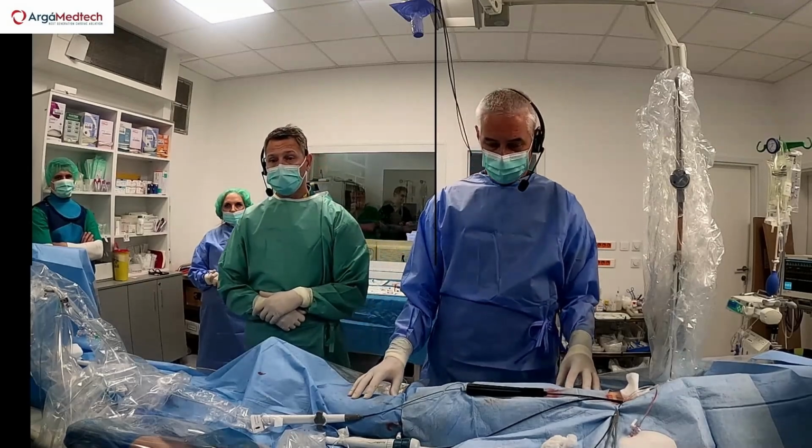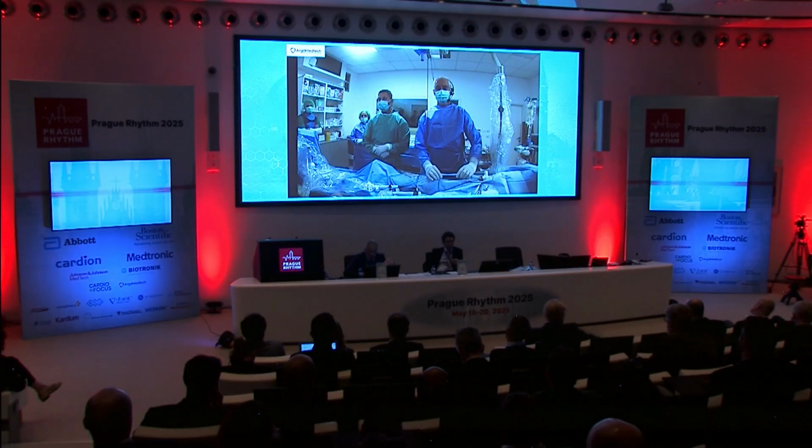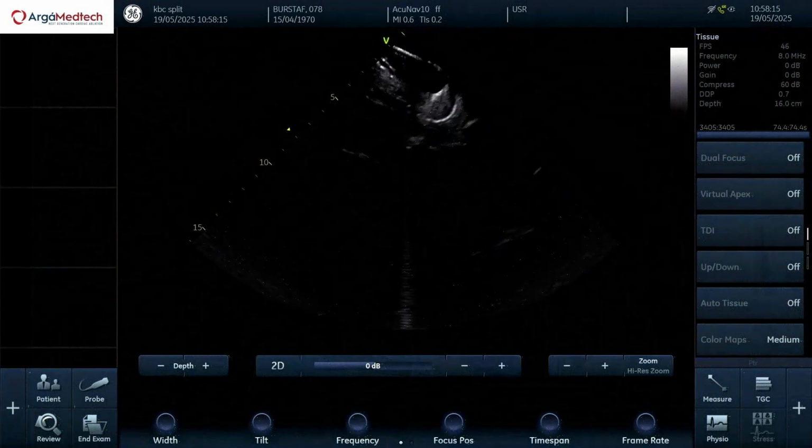So this isthmus was relatively easy because it was more or less flat. But sometimes you have some deep excavations. So then you use a focal, or how do you cover that? So please look on ICE now. Look on ICE now. Here I am. If you want to give more septal, you see contact?